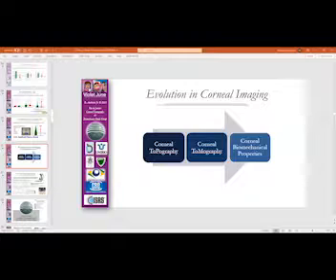We have whole eye wavefront data, and eventually some cellular data that we can get with confocal microscopy may improve the detection of ectasia. And not only detection, it's diagnosing, prognosing, follow-up, planning the treatment, all these aspects of the applications of diagnostic imaging.